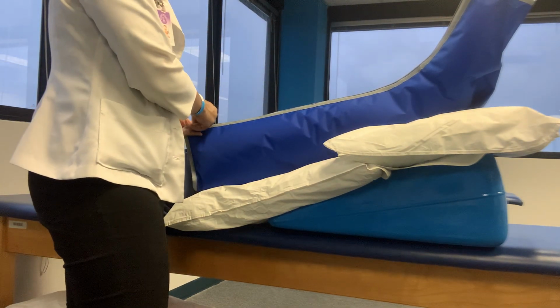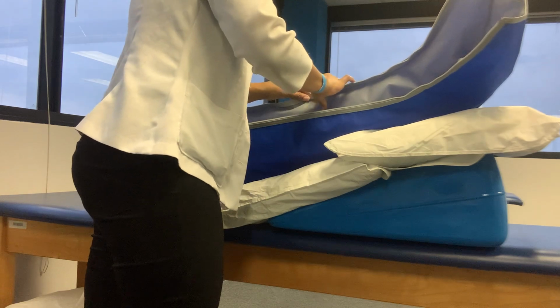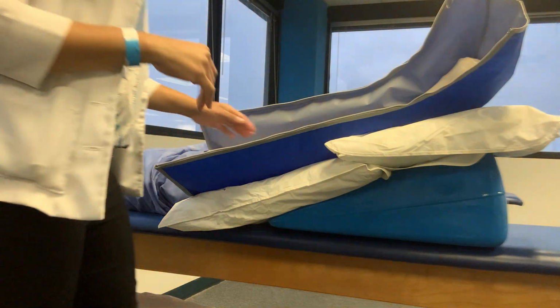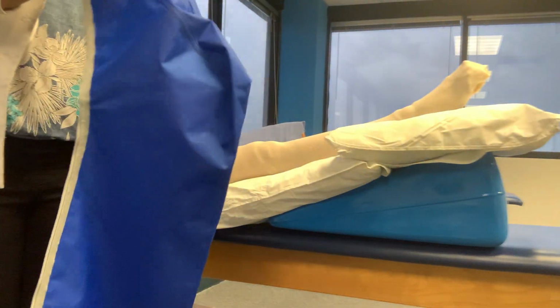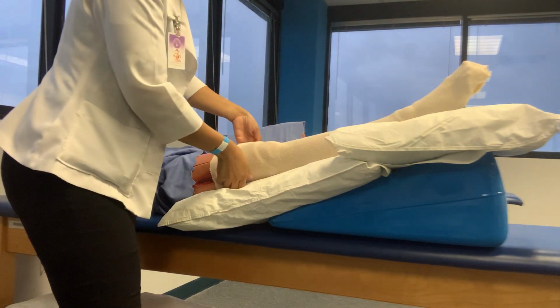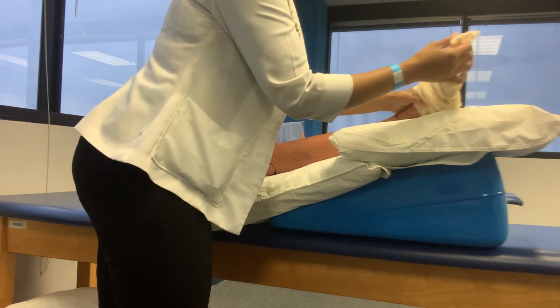So you'll check on your patient. The sleeve will deflate, but I will say for your treatments, we'll try our best to make sure it doesn't inflate on you. So you can unhook the sleeve. I'll see you Tuesday. Okay. So we unhook the machine, you remove the sleeve, and when you place the sleeve, you want to make sure we keep the sleeves flat. So you remove the sleeve, and then you remove the stockinette. So again, just still being gentle, because sometimes that skin is really sensitive as well.